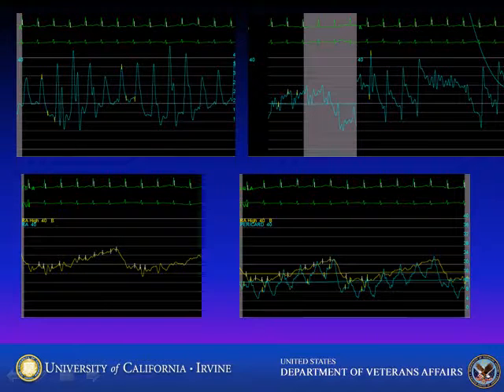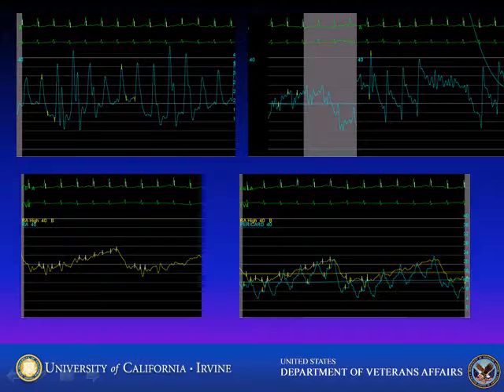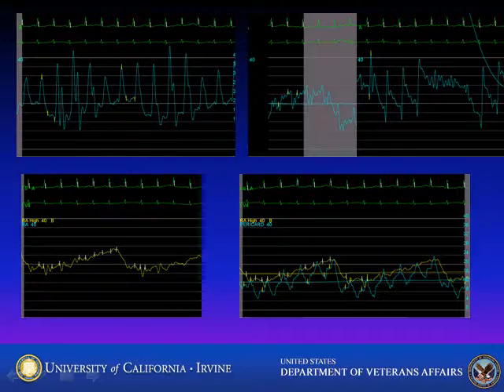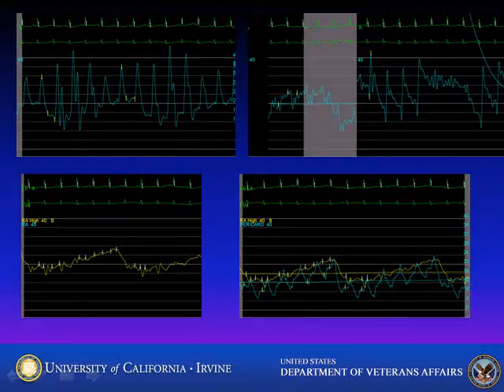With the catheter in place, we were able to record hemodynamics while extracting fluid. The hemodynamic panels demonstrate some very remarkable findings. Starting on the upper left, we see the right ventricular pressure — a very bizarre looking pressure waveform — with a diastolic pressure averaging 20 and marked respiratory variation. On the top right, we see initially the wedge pressure averaging about 20, and then the PA pressure past the gray bar, with diastolic pressures of around 20.